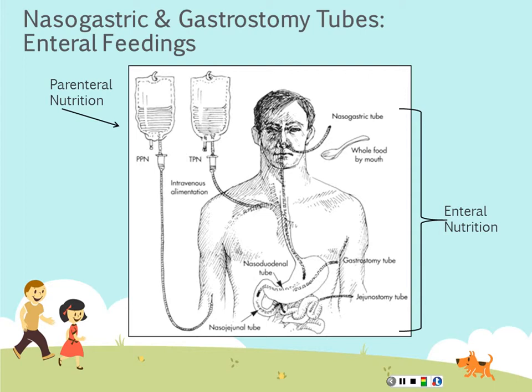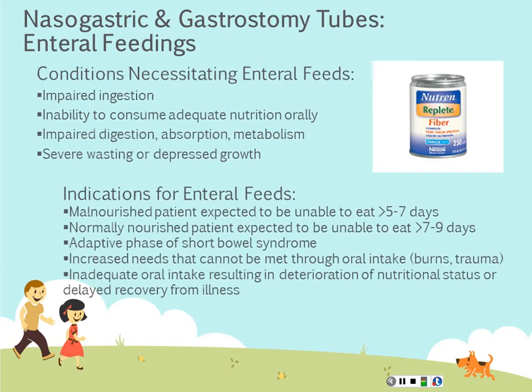Couple other tips for administering medications when you are giving capsules. Obviously, you can't flush the capsule through the tube without it clogging. And so as long as it's not sustained or extended release, then you are able to open and mix the sprinkles or the powder with water to give it in a tube.